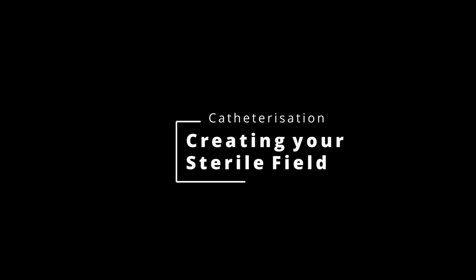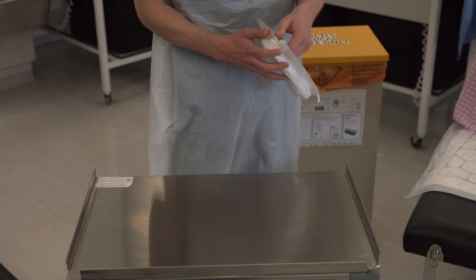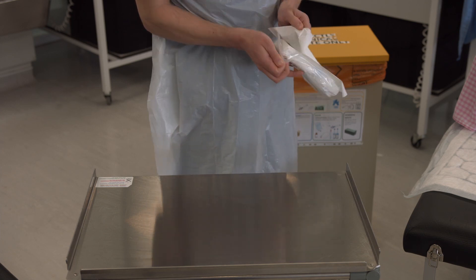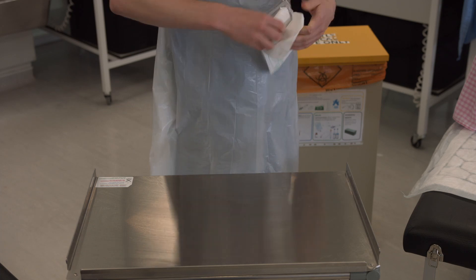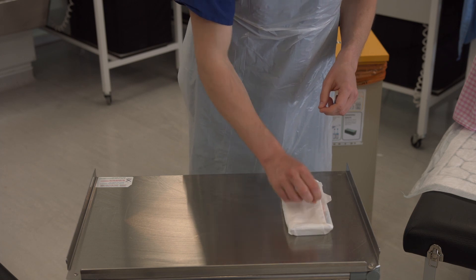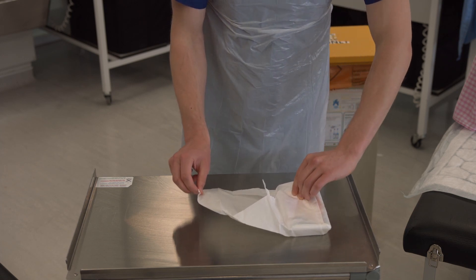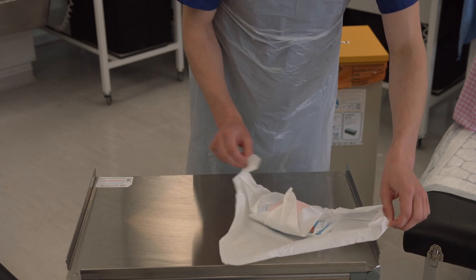This video will show you how to create the sterile field on top of your trolley. Start by removing the outer packaging to the wound care pack and placing it on the trolley. Carefully lift up each corner in turn and open out the wound care pack. Touch only the corners and the outside of the sheet.